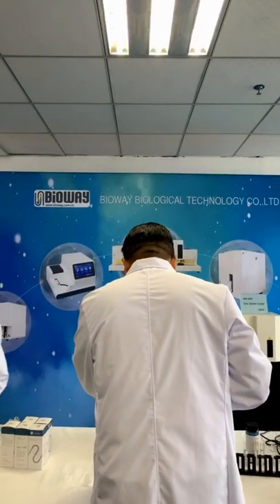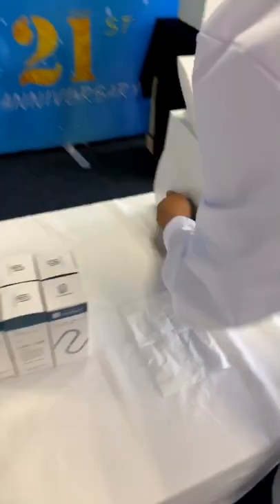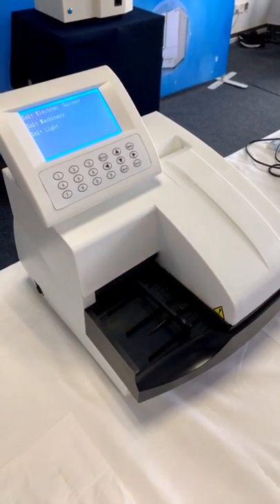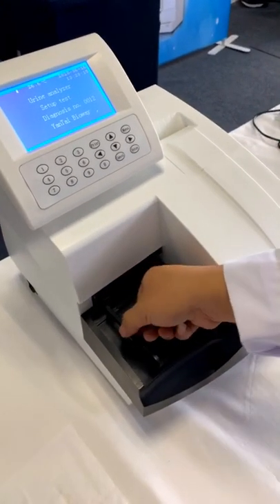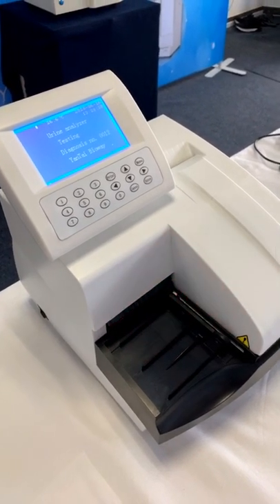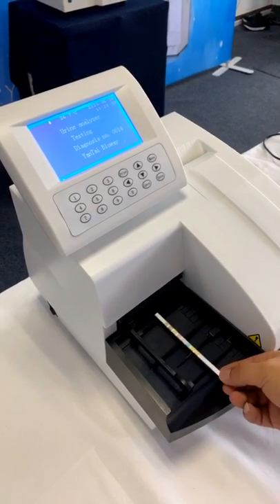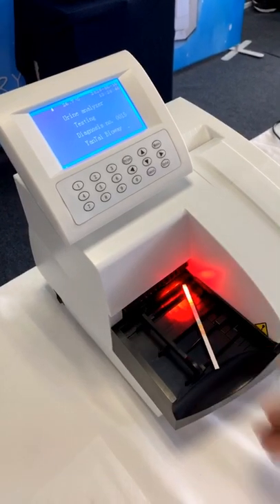So now I will show you the process. At the beginning, the machine will start working, testing one by one. First, you need to check whether the pusher is in the correct position. Okay, so now we can see the first one, the second one, the third one. Even if the direction is not very correct, we can see that.